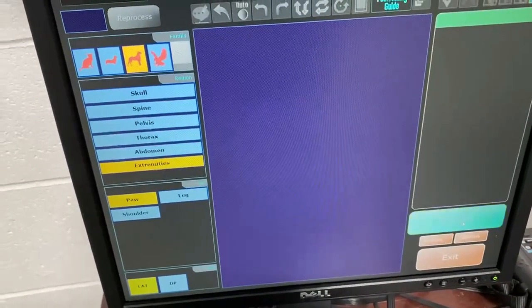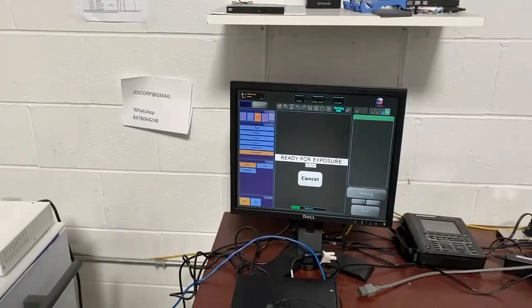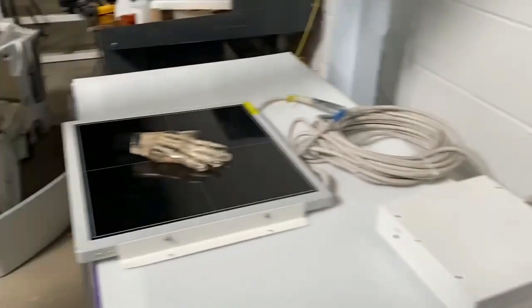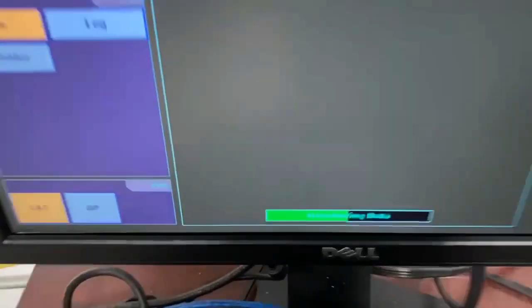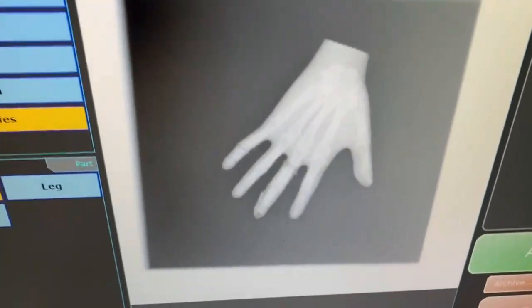We can go ahead and run an image. I will stand behind the lead wall here. It gives you 30 seconds to take the exposure, so it already took the exposure. And I put paw in there because we'll be taking the hand. So it is transferring the image now. And that comes up here and it finishes processing.